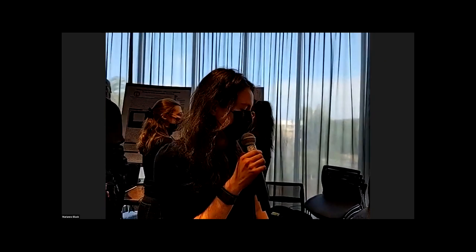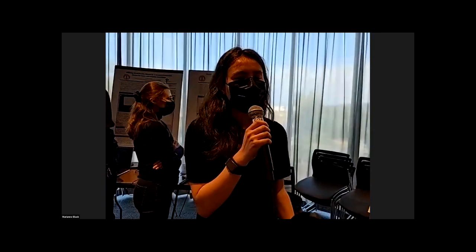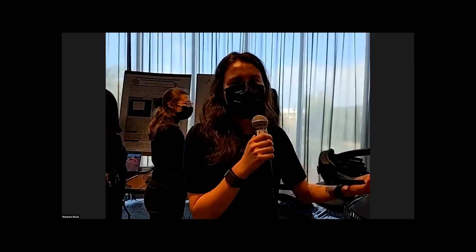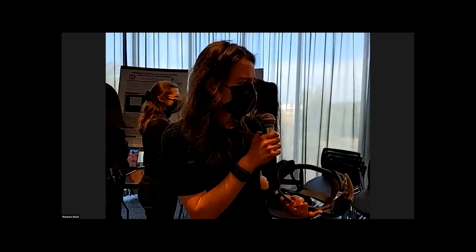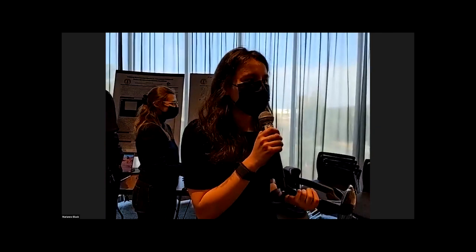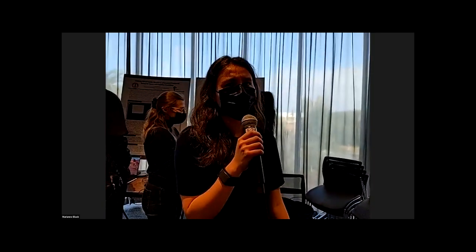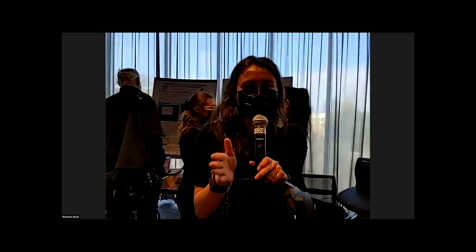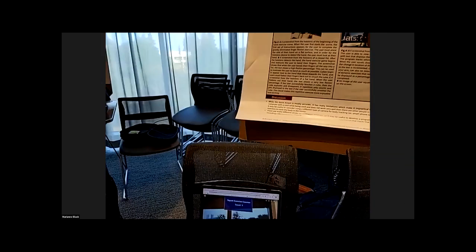I realized through that process, though, that at least at the moment, the way I have it set up is a little impractical because you would need to hook this up to a computer every single time to track your movement. So I decided to switch over to more hand tracking related exercises, which is used a lot in stroke rehabilitation. And there are a lot of really, really boring exercises, like there's a finger flexion exercise, for example, that's really boring. So I have a video that I can show you of that.